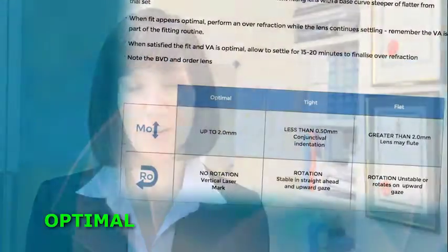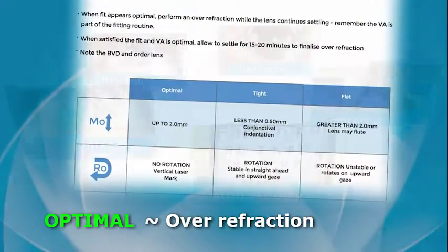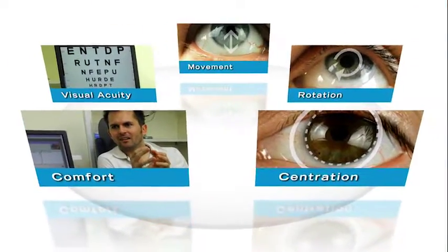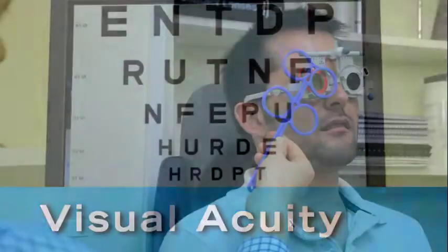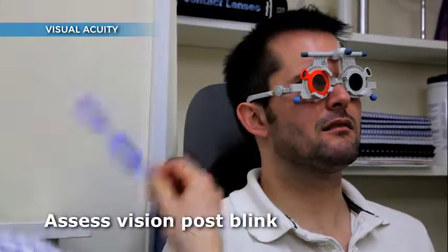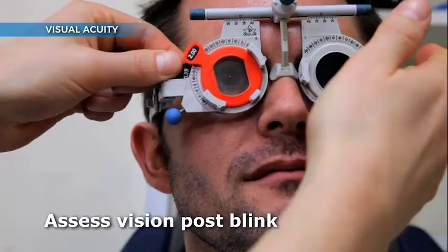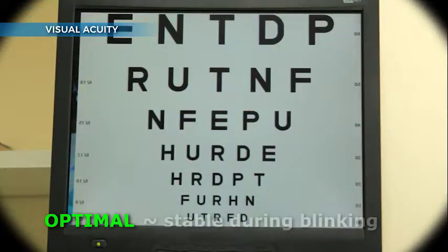If the fitting characteristics of the lens match with those in the optimal zone, perform an over-refraction while the lens is settling. With this initial over-refraction in place, assess the visual acuity. Assess whether the vision remains stable or is better or worse after the blink.